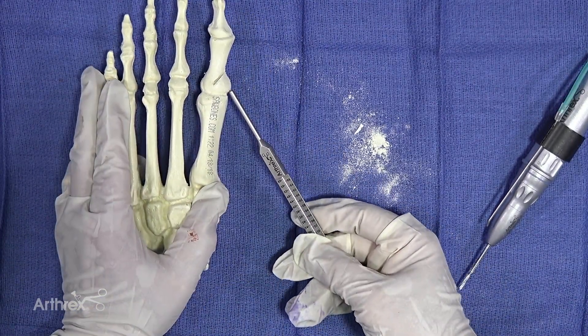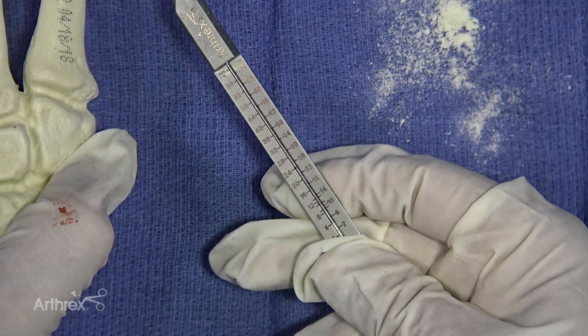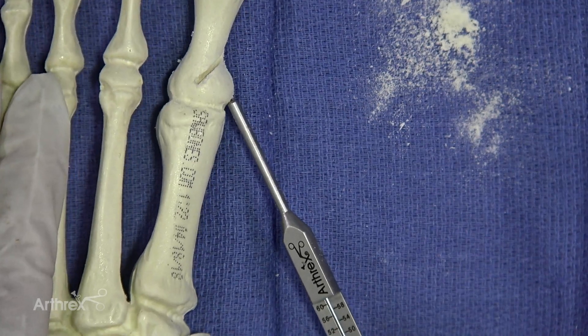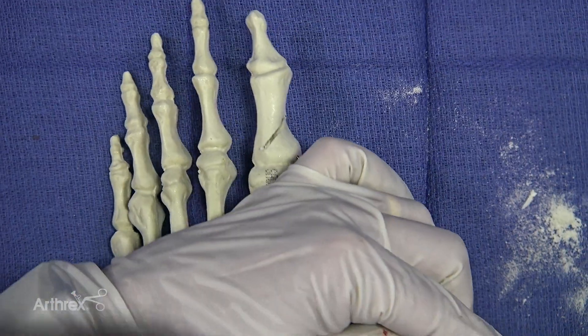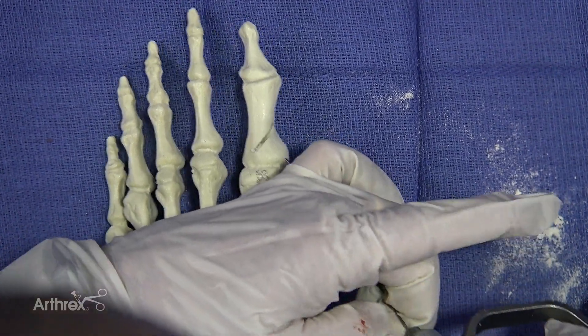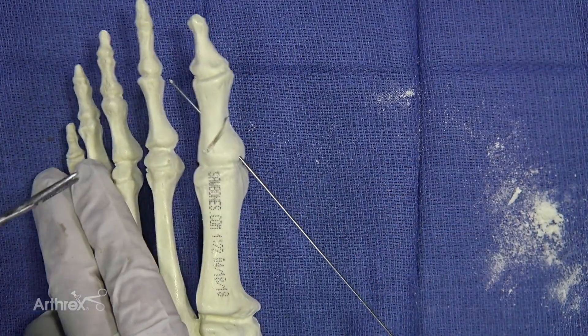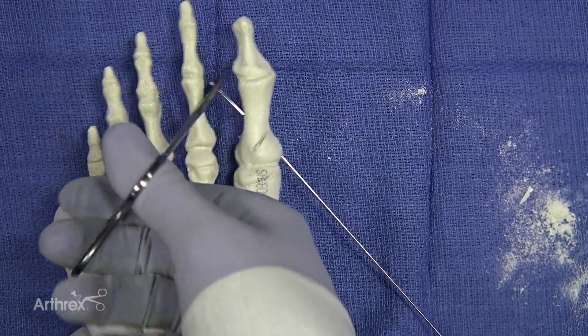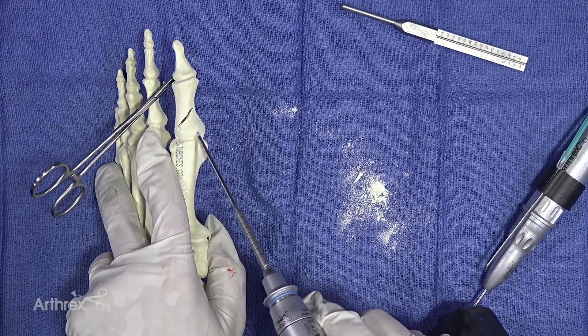At this point you could measure 24 — you're measuring a 24. You could maybe go a little bit shorter to a 22. Bring it out the other end and then go ahead and drill it.